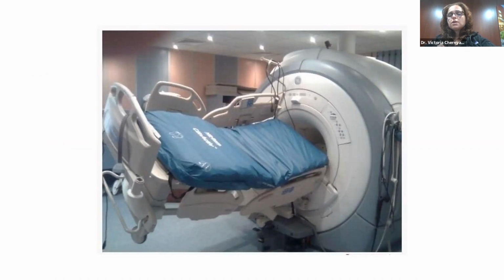All the equipment, and there are no exceptions, to the point where if the patient is coding in an MR scanner, the patient has to be taken out of the MR room before resuscitation is started. Even the crash cart cannot be brought into the room because it will fly into the bore, and there's no way to take this thing out of the scanner without quenching the scanner, which is basically unplugging it, which is a very expensive and lengthy process.